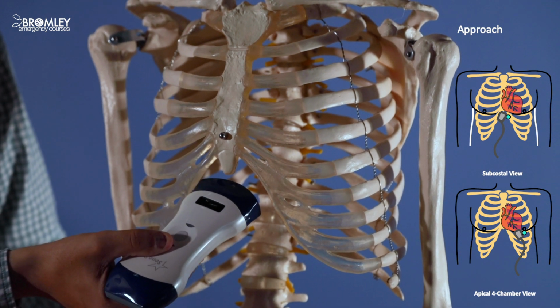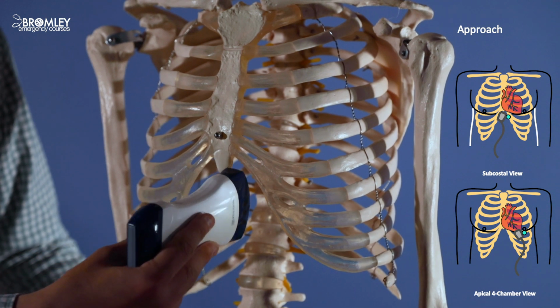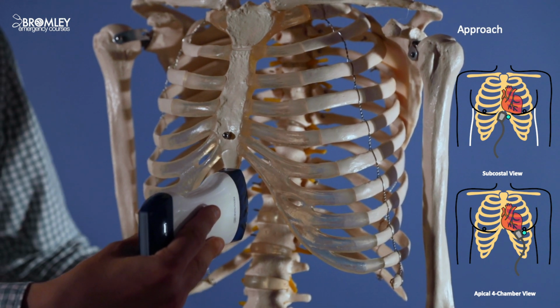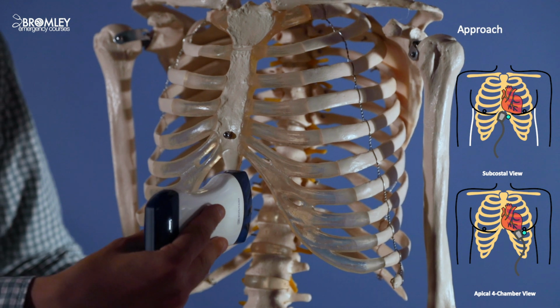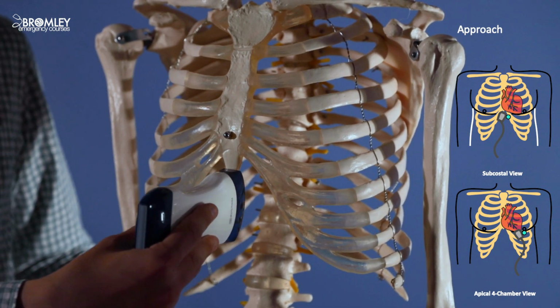To look at the IVC, we just rotate the probe anti-clockwise so that the probe marker is towards the patient's head, and then we'll see the IVC coming out of the right atrium.